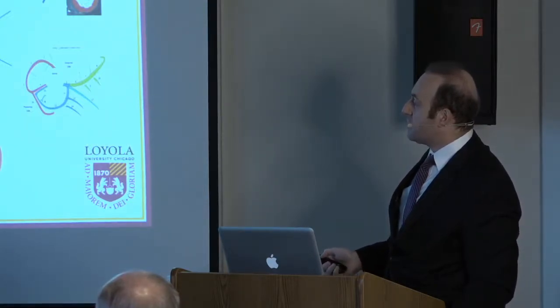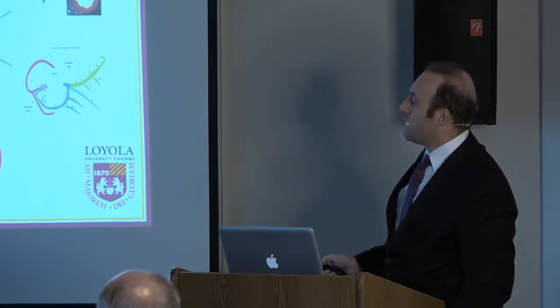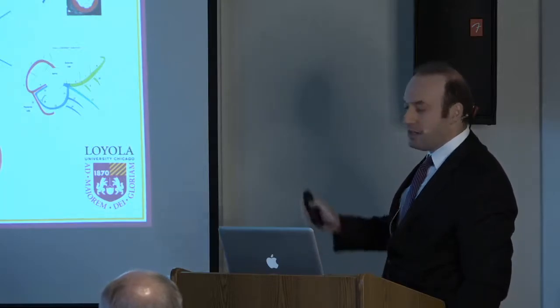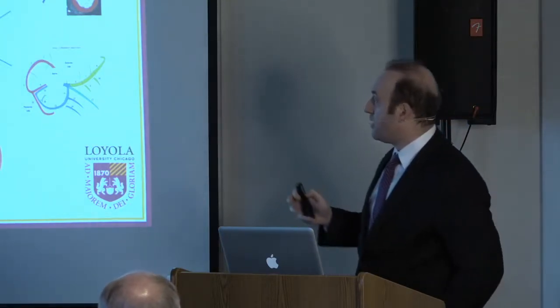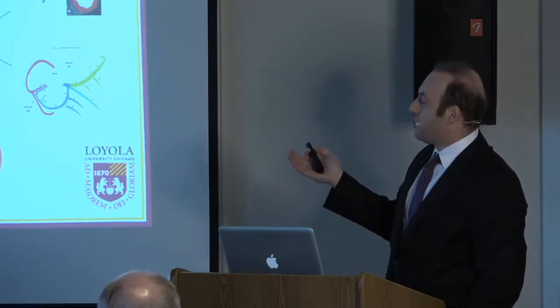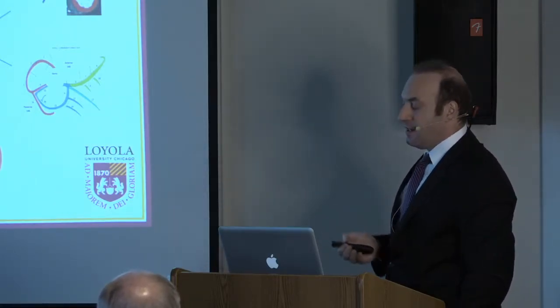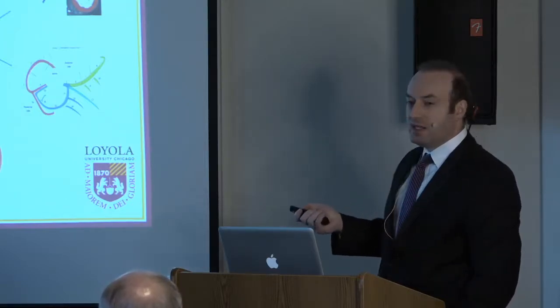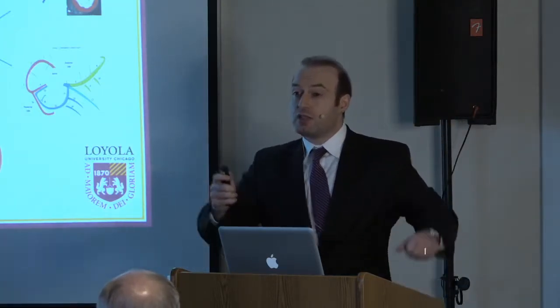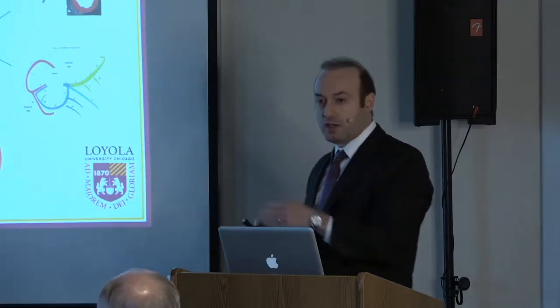From the CT scan, we can assess this new metric called volume to mass that I'll touch on one or two slides later on. Basically looking at supply-demand mismatch in an individual patient's coronaries, which may shed light into the ischemic potential of non-obstructive lesions. And then we'll talk about that in a little bit.